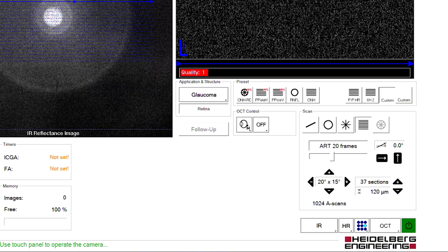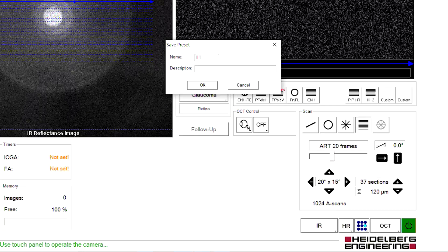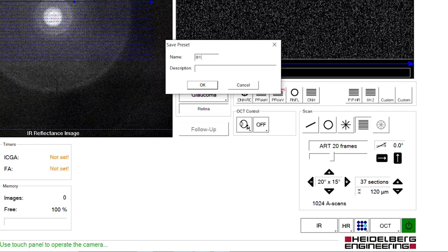You can then add a customised label, in this case we've used IIH1, and save this for quick access in the future.